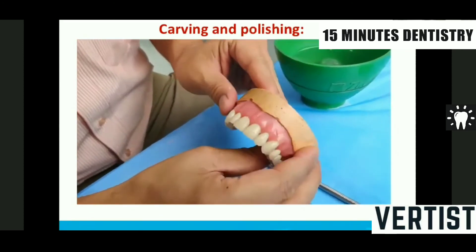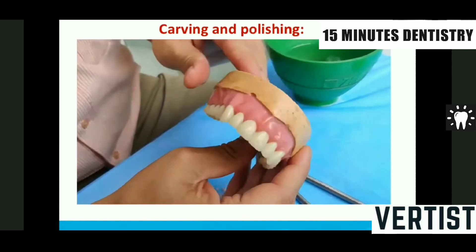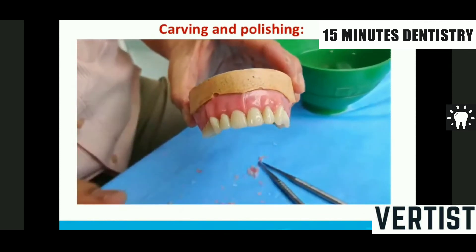It is better to use a hard baseplate wax. Do not make the roots too prominent — the commonest mistake I see in students is excessive root carving. The root curvatures should be very subtle and smooth throughout. I do not prefer any root carving in the posterior aspect beyond the canine; I prefer only the free gingival margin carving there, as the posterior aspect should be as smooth as possible.